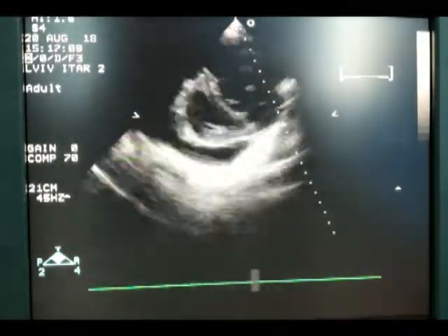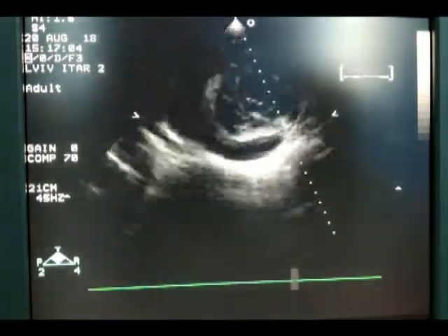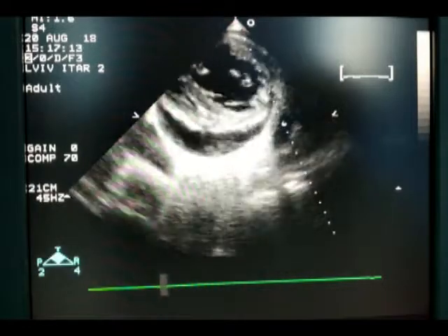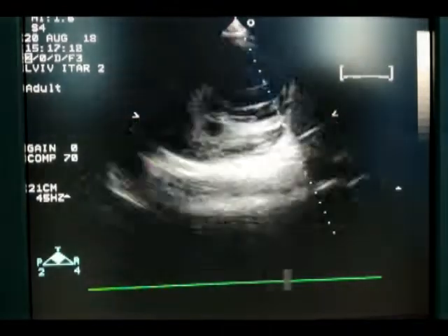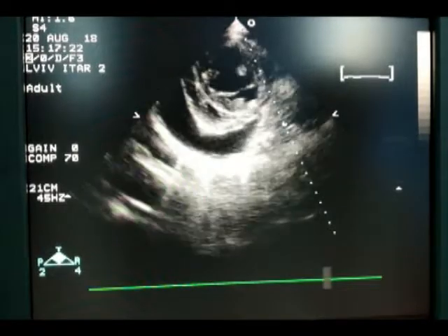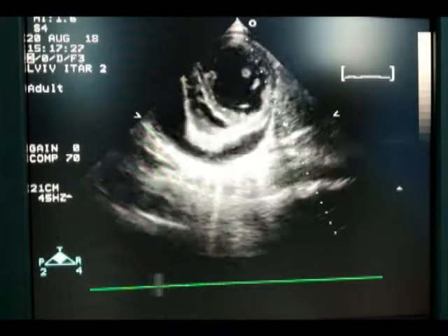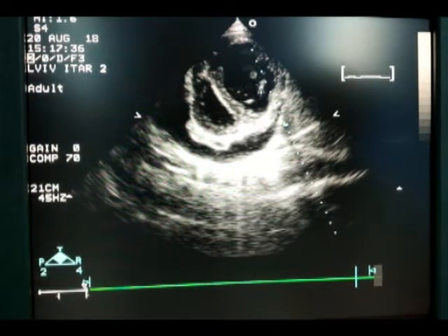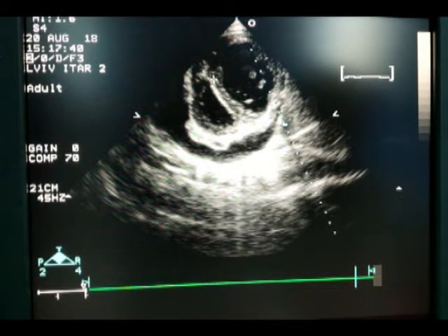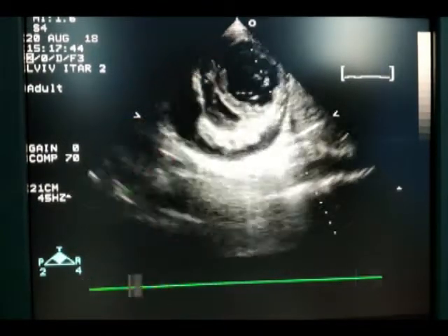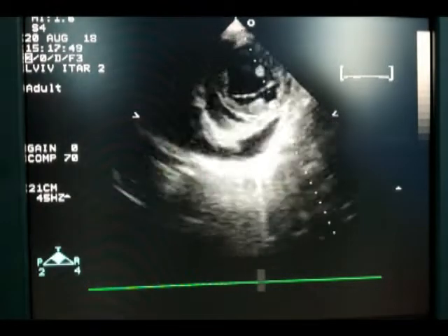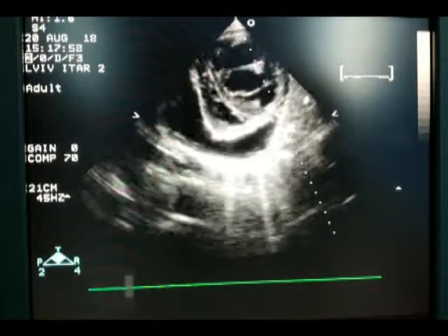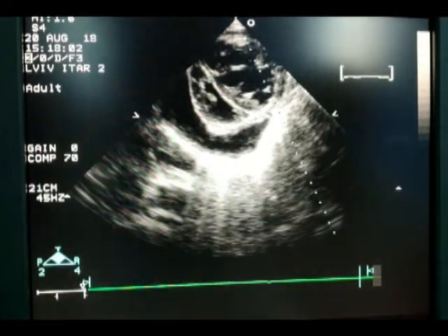Now we obtain the short axis view. Please note that the heart anatomy is significantly deformed. The left ventricular cavity is very small and the right ventricular cavity is very large. Look at the shape of the left ventricle and interventricular septum — the interventricular septum is flattened, which is an indication of very high pressure in the right ventricle. The interventricular septum also participates in the systole of the right ventricle. Take note of the fluid around the heart.